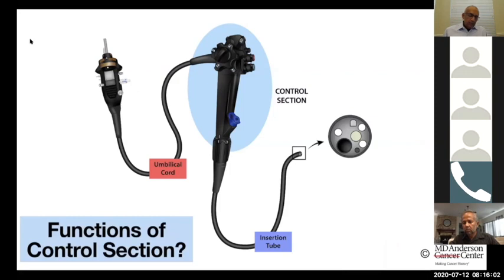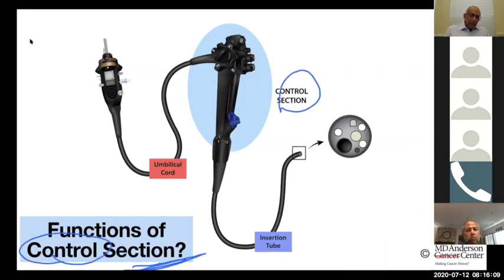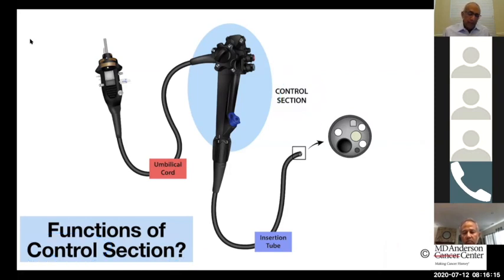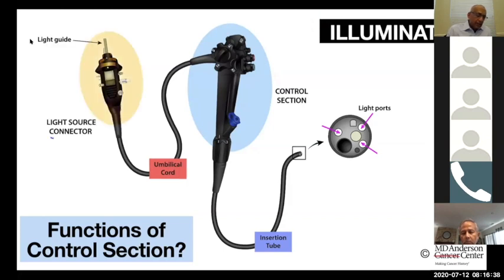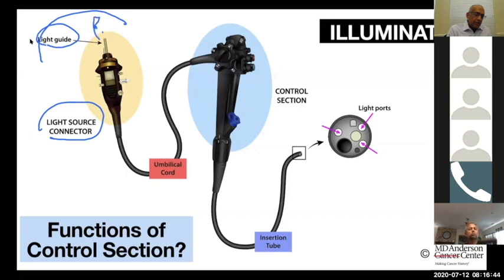Let us talk about the control section — this is what you're going to hold in your left hand, and you can do several different functions. You can illuminate: when you hook the scope in, put the button on, and turn the light on, the light guide brings the light to the distal end. The light comes from the light source connector where we connect it to the processor, travels through the light guide, and comes out at the light port.